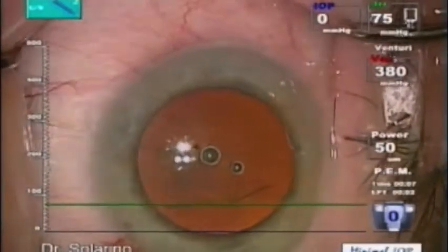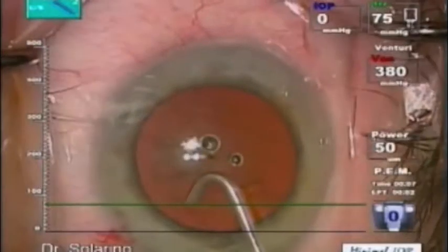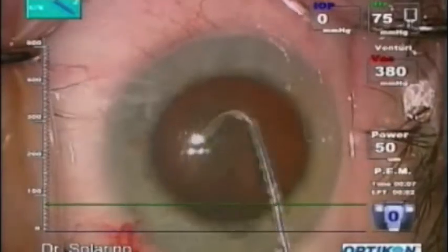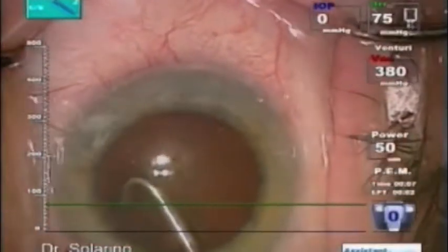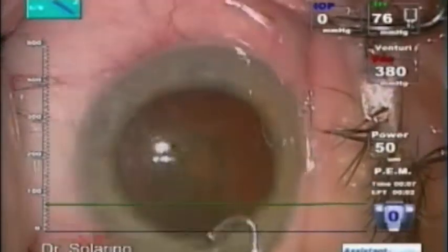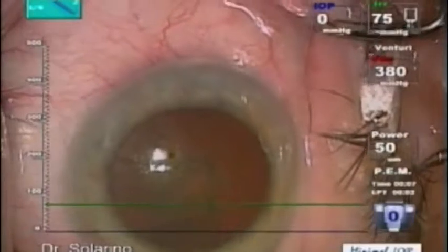I'd like to really spend more seconds doing a proper hydrodissection under the tunnel, and also trying to do a good hydrodelineation, just to have the possibility to move the nucleus more easily.